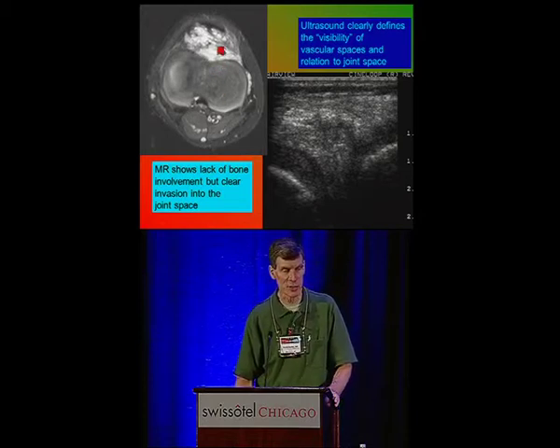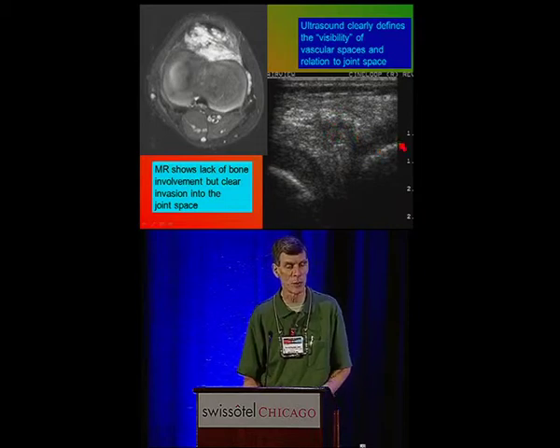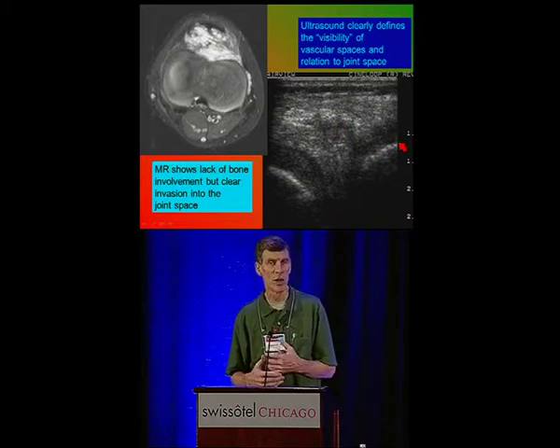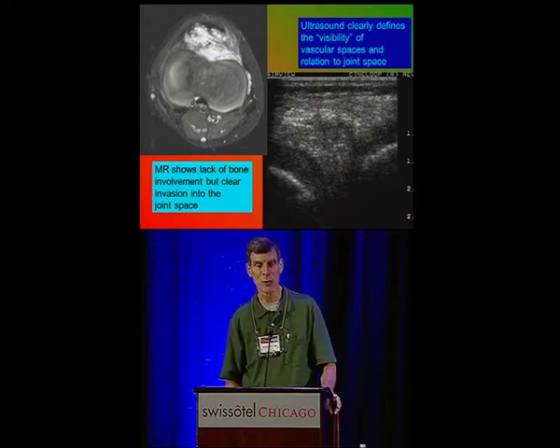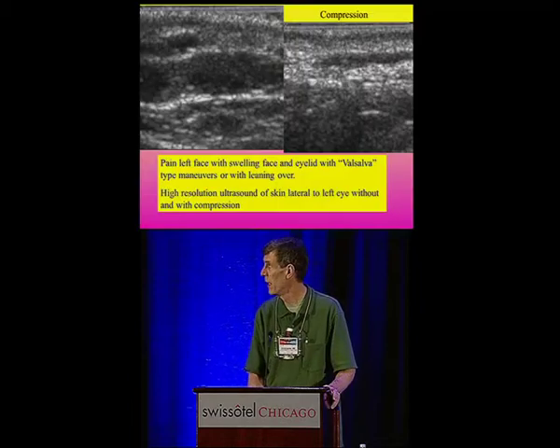Ultrasound is used in cases like this to make sure that we can see the vascular malformation diving down into the joint on both sides, and exactly where the abnormal vessels are that we would be using to puncture. And we often do a screening ultrasound just so we have a baseline study so we know exactly how we're going to puncture these as well.